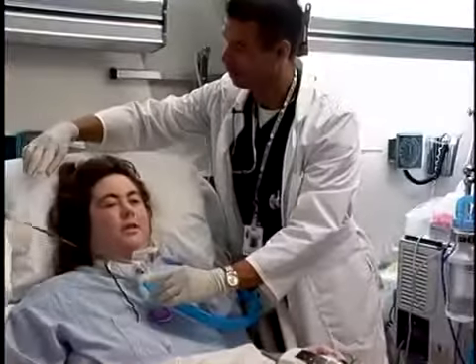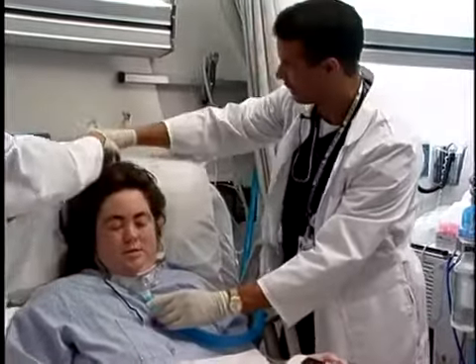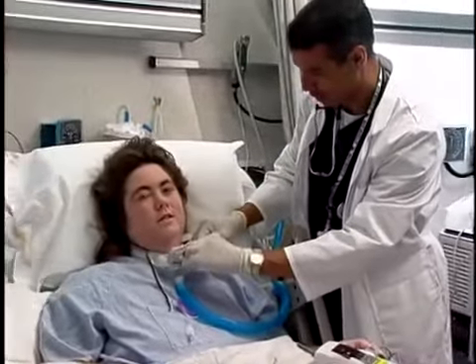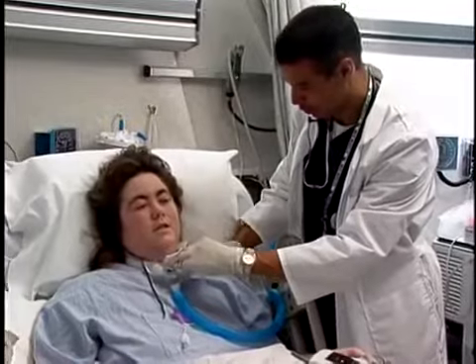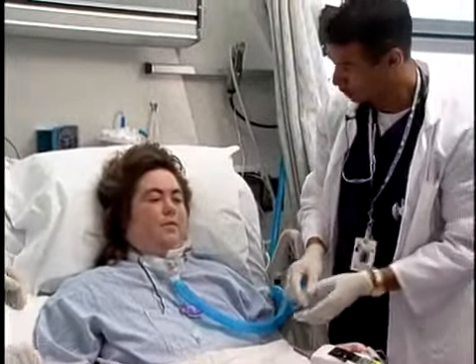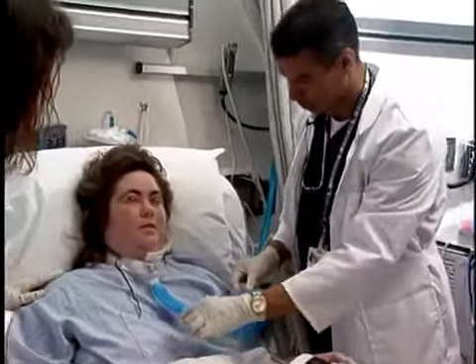Humidity can be applied at the tracheostomy tube site with the valve in place via use of a trach collar or T-piece. The performance of a heat-moisture exchange filter may be reduced when used in conjunction with the valve, as exhaled air no longer passes through the filter, which traps moisture.